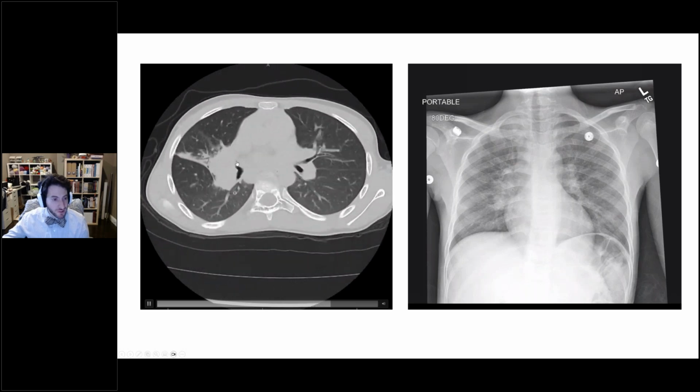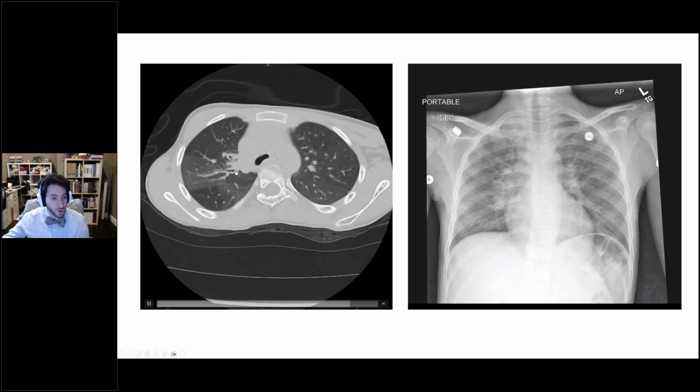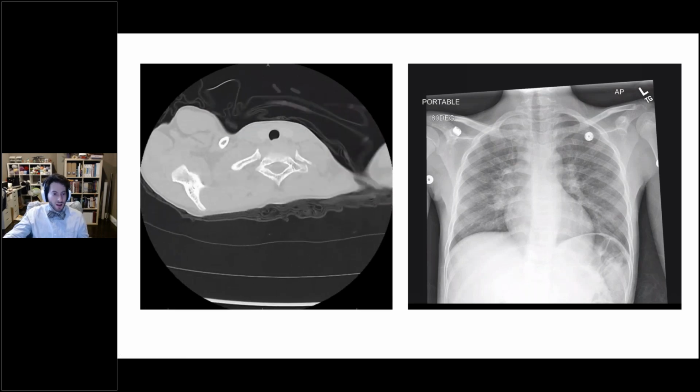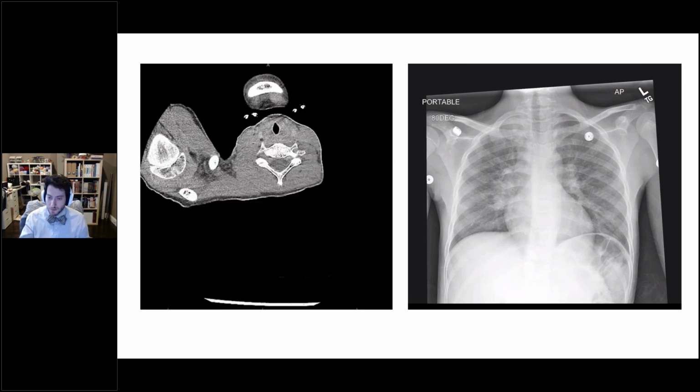And so our pediatric surgery colleagues have been asked to perform potential VATS and surgical removal simply for diagnosis of this hilar mass. And they had reached out to us, knowing some of our capabilities and the history of working with us over the past 15 years, and said, I really think that this could be amenable to a bronchoscopic evaluation, and can you help us?